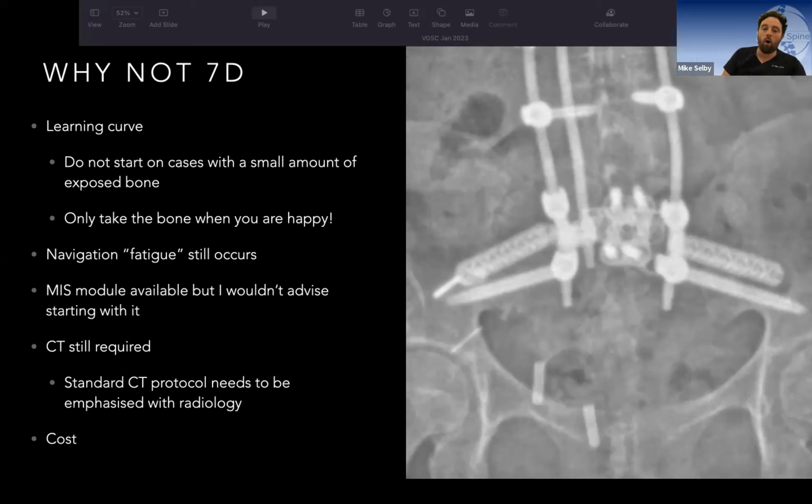Now, we spun that wire. It's just sitting in the bone, completely safe. So I left it alone and told the patient about it later. And she's doing fine, so she's very happy.